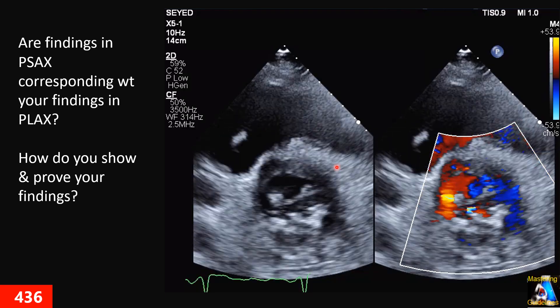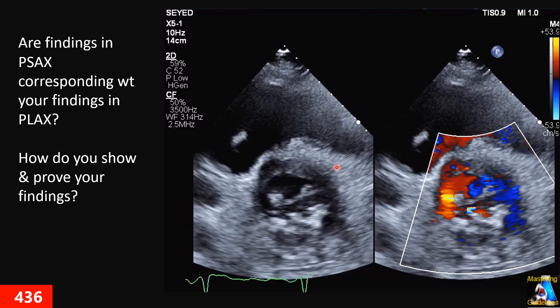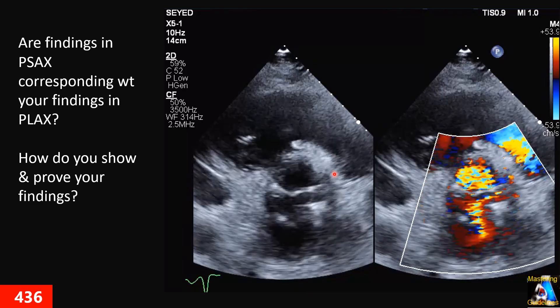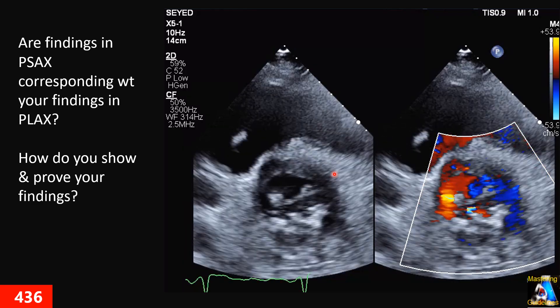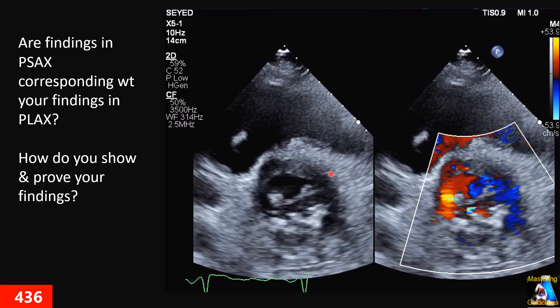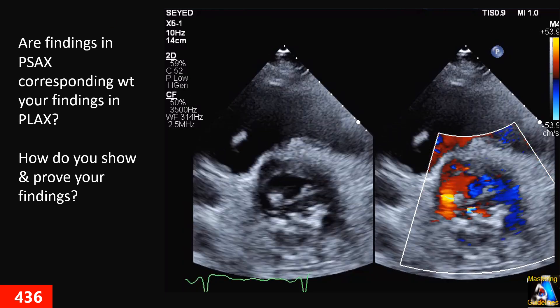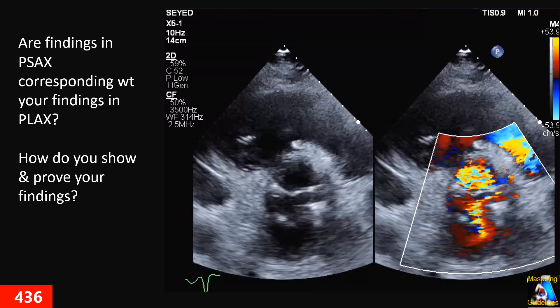You have to go to extra studies — not just the initial images and color Doppler. What are those and how do you show and prove them? The same approach as the initial images.